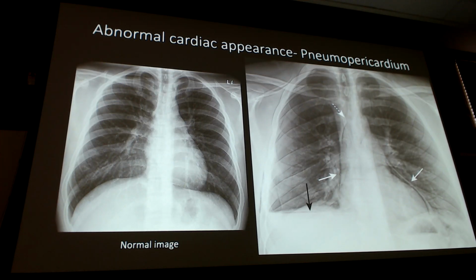And why don't we see the diaphragm sign on this? Because this one is just pericardium. This is not the full mediastinum. Bingo. What do we have on that black arrow? The black arrow is pointing at what? Not the diaphragm. Fluid, right?